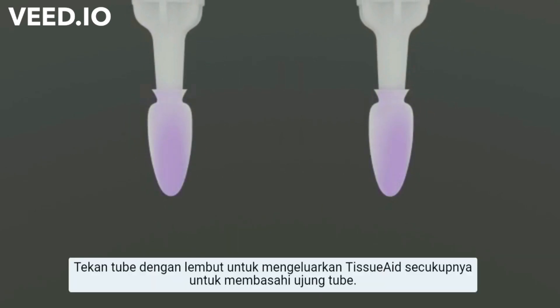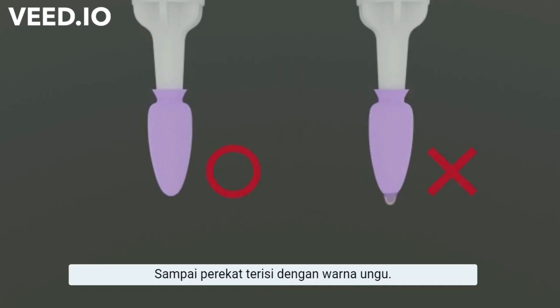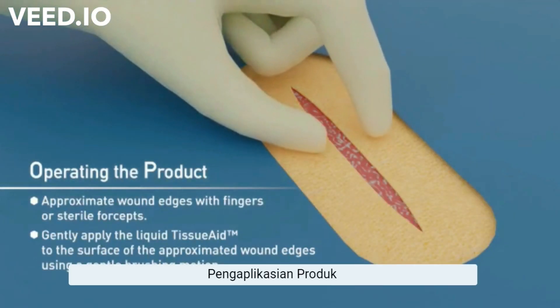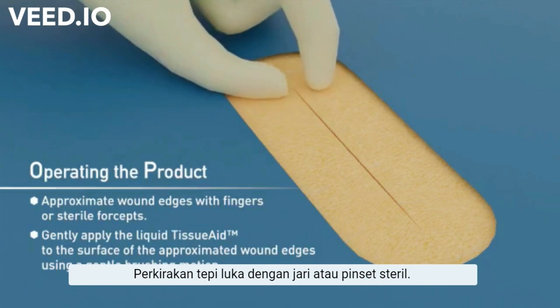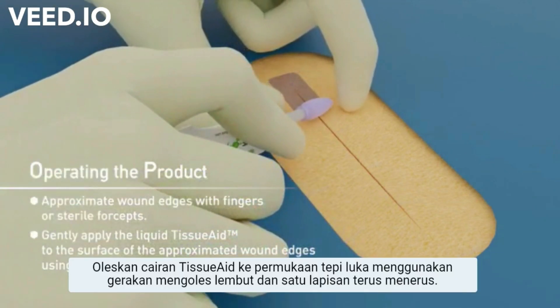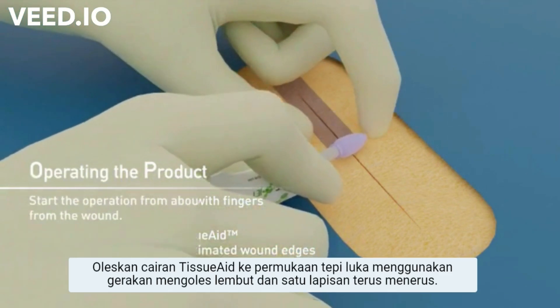Gently squeeze the tube to express enough Tissue Aid to wet the soft tip. The adhesive is violet in color. Gently appose the wound edges with fingers or sterile forceps. Gently apply the liquid Tissue Aid to the surface of the approximated wound edges using a gentle brushing motion in one continuous layer.